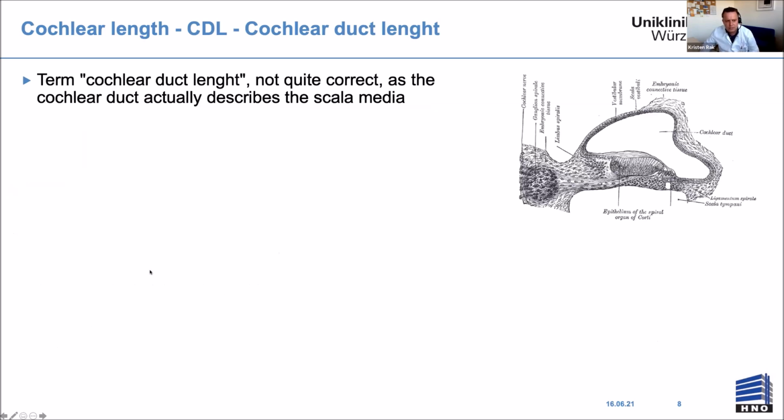So further on, I would like to talk a little bit about the expression cochlear length, cochlear duct length. I'm not totally sure if the term cochlear duct length, which we use at the moment, is quite correct, as a cochlear duct, as far as I learned it, really describes the scala media.